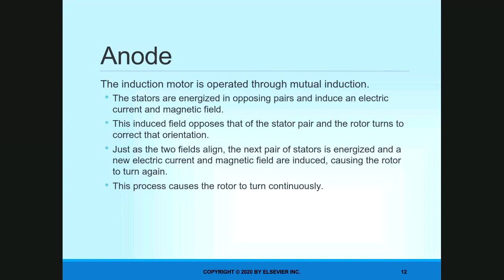This operates the same exact way that the locks on the X-ray tube work. When you depress the lock, it releases the magnet and allows you to move the tube. Then when you let the lock go, it clamps down and becomes a magnet again. The stators act in the same way. When you supply them with electricity, they become magnetized, it spins the rotor, which in turn spins the anode.